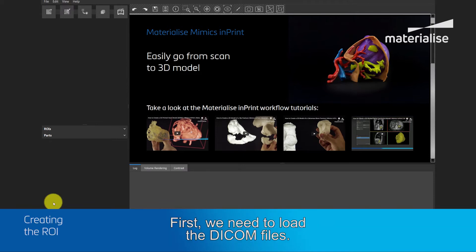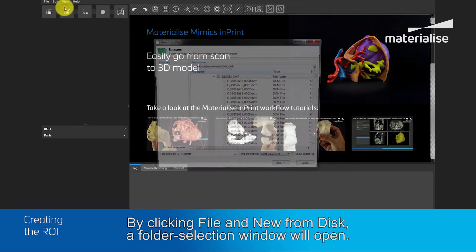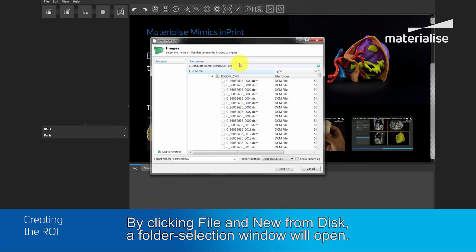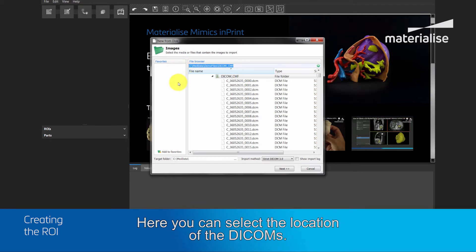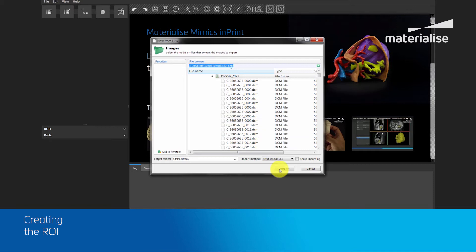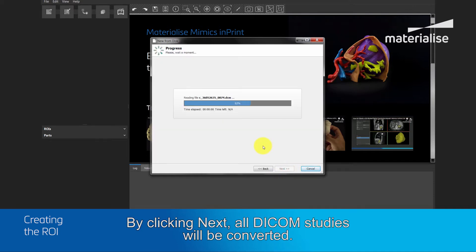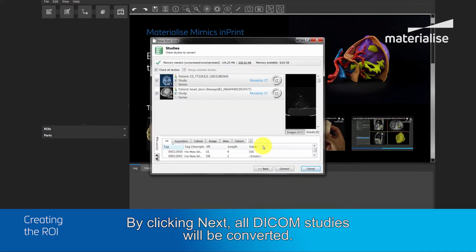First we need to load in the DICOM files. By clicking File and New from Disk, a folder selection window opens. Here you can select the location of the DICOMs. It is important to select the whole folder, not just only one file. By clicking Next, all the DICOM studies will be converted.